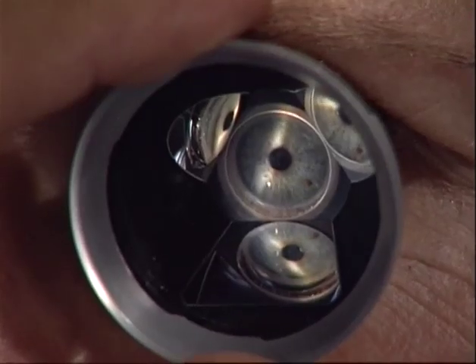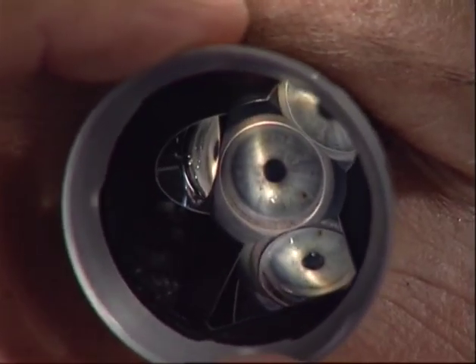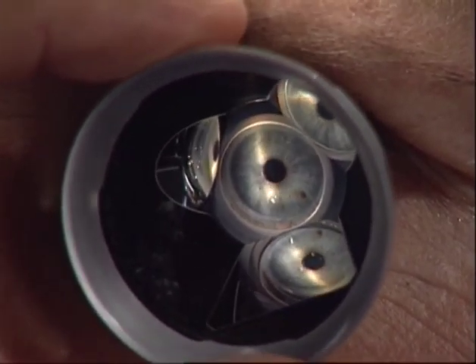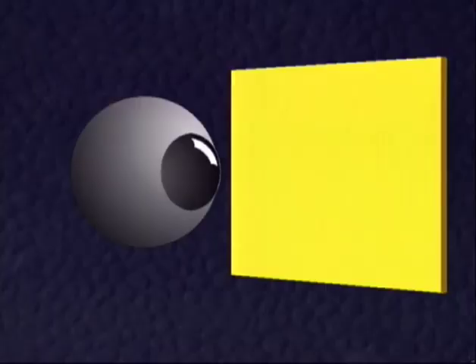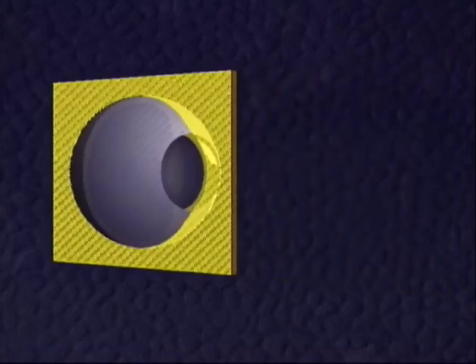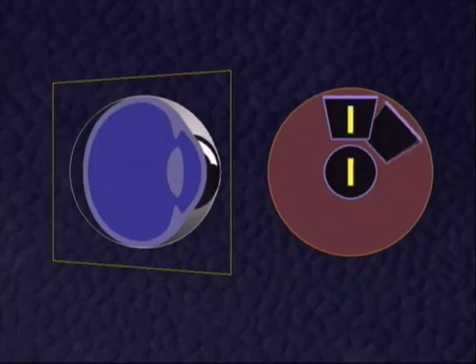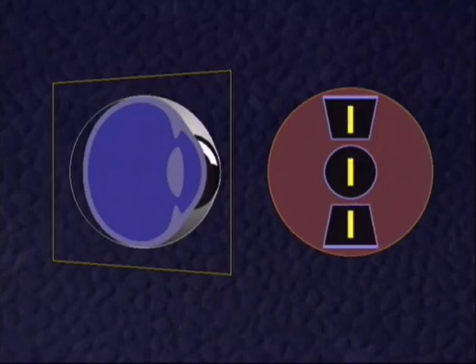When the contact glass is rotated, the optical knife is also rotated. Let us analyze this. To obtain an optical section in the vertical meridian, the slit beam is oriented vertically in the central part of the contact glass, and in the mirrors positioned at 12 and at 6 o'clock.